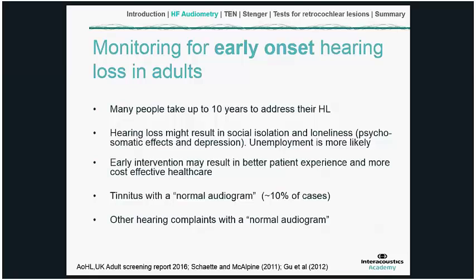Also, it's well worth taking a moment to mention the phenomenon of tinnitus in the case of a normal audiogram. It's generally accepted that tinnitus is triggered by hearing loss. But there's a certain enigma surrounding a small proportion, around 10% of tinnitus cases, where there's no apparent hearing loss, and so they're described as cases of tinnitus with a normal audiogram.